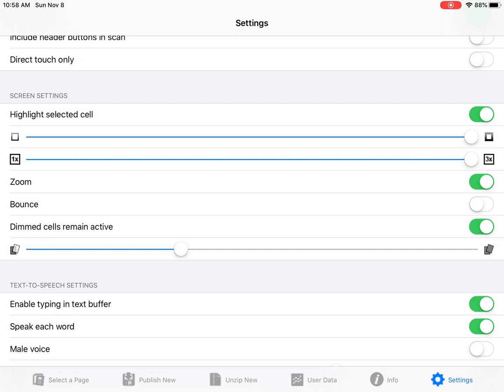However, we really see the need to keep images in there so kids can see it, but you can make them inactive. So when it's selected, maybe it doesn't voice activate, but you can definitely recognize that communication when they touch it. And then you could decide how opaque it is. But let's just focus on these first few settings that I changed.